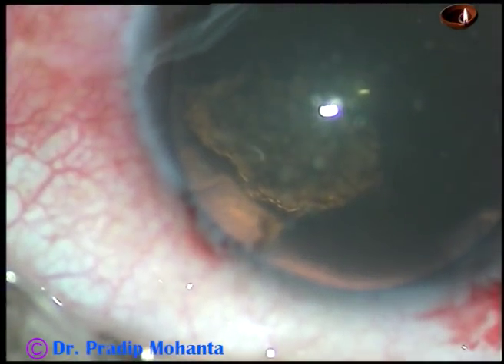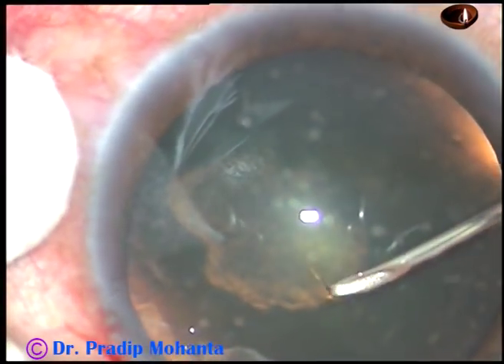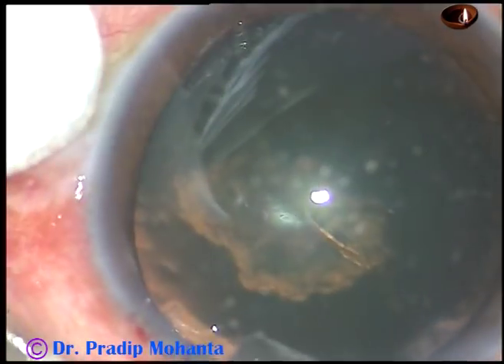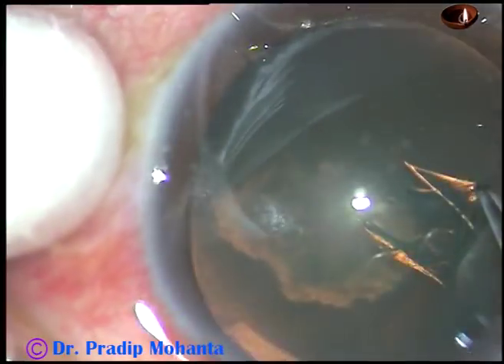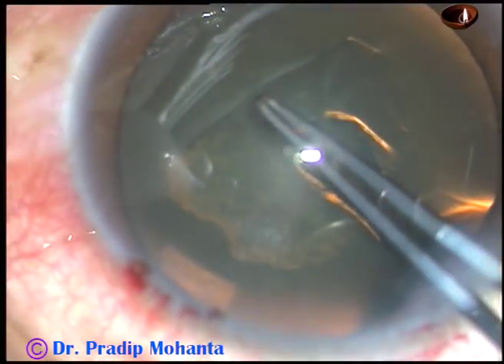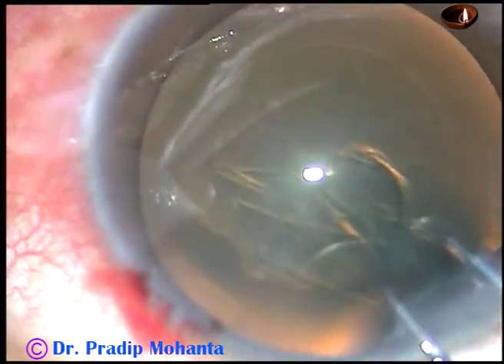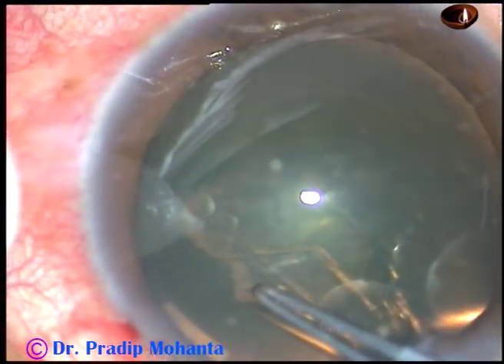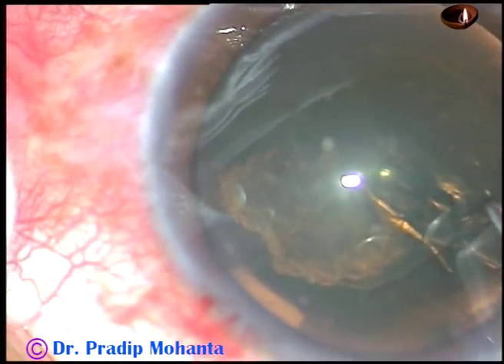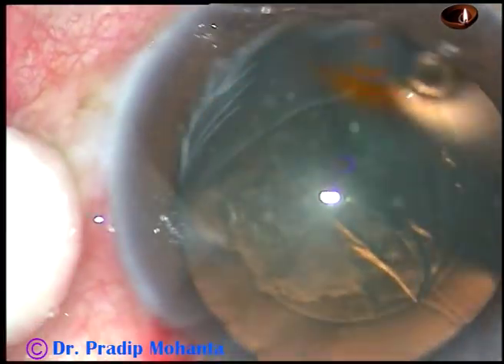Now capsulorrhexis is to be done. The anterior capsule is incised with the 26-gauge bent needle and a nice flap is raised. I hold this capsular flap with a Utrata forceps, going anti-clockwise all around, remaining at a certain distance away from the margin of the dilated pupil, and thus I perform a nice 5mm rhexis.